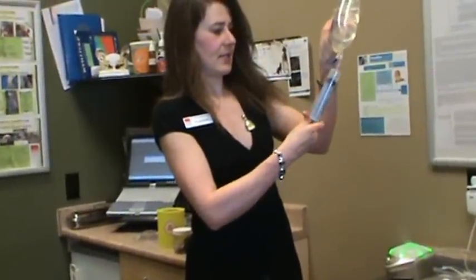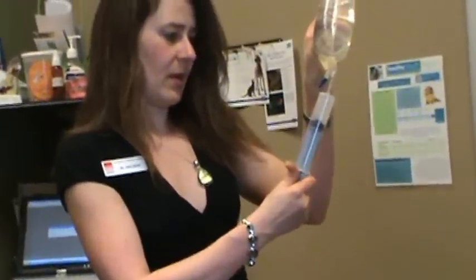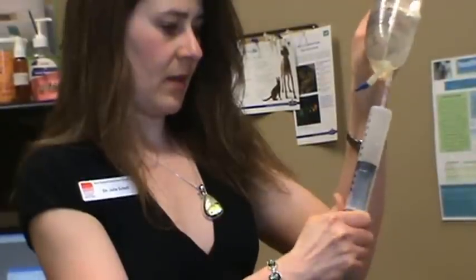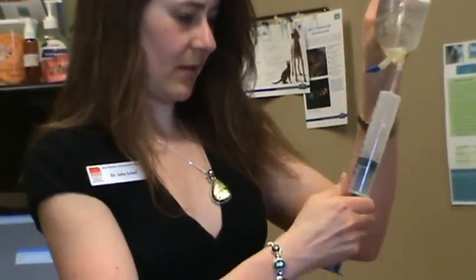We basically draw up another 60 cc. For him, his dose today we're going to give him up to about 280 to 300 cc throughout the day, just because he's pretty dehydrated. But usually we don't have to give that much, so we're going to drop another dose like that.